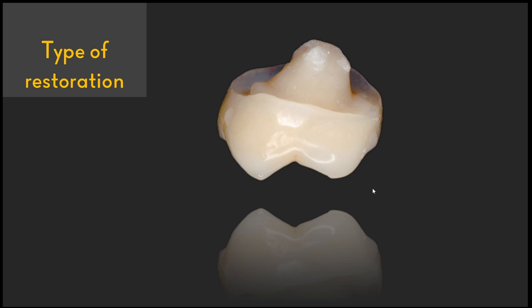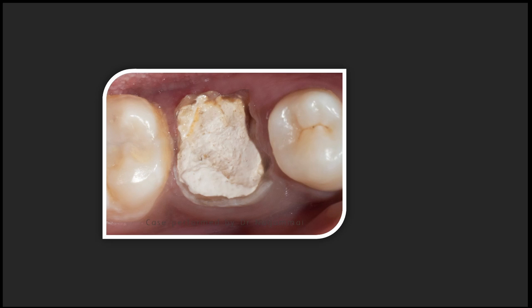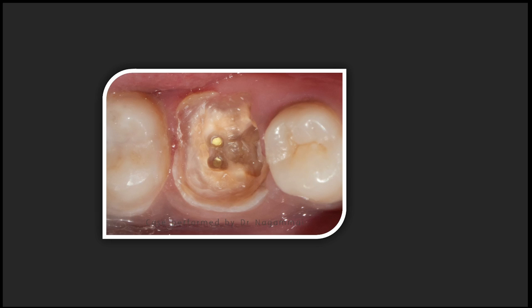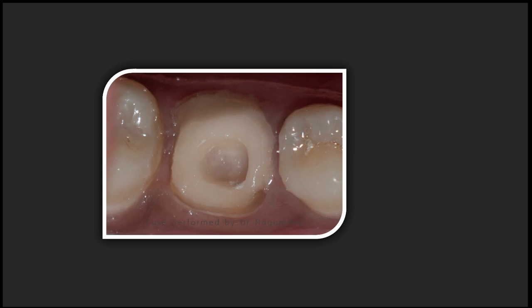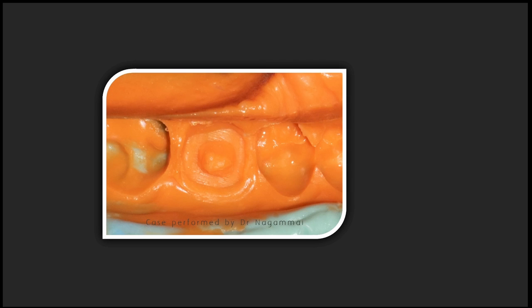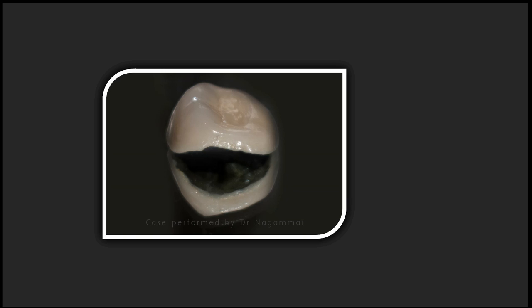Let's see a case where an endocrown restoration is given for a grossly decayed tooth. Almost no clinical crown structure is remaining — it is too decayed. After finishing root canal treatment, the tooth is sealed with temporary restorative material. After removal of the temporary coronal seal and 2–3 mm of obturation material from the orifice, the cavity is built up with glass ionomer cement. The internal preparation and circumferential ferrule preparation are completed, an impression is made, and a metal-ceramic endocrown is constructed, verified on the cast, and cemented.